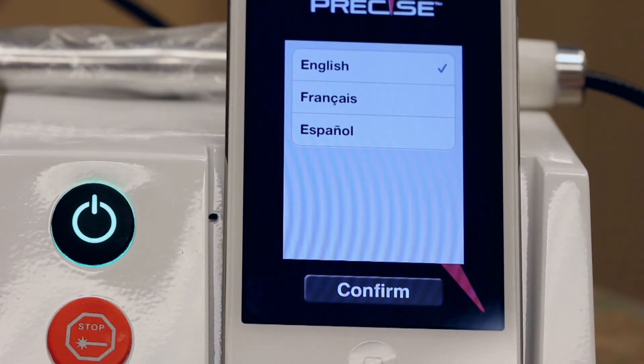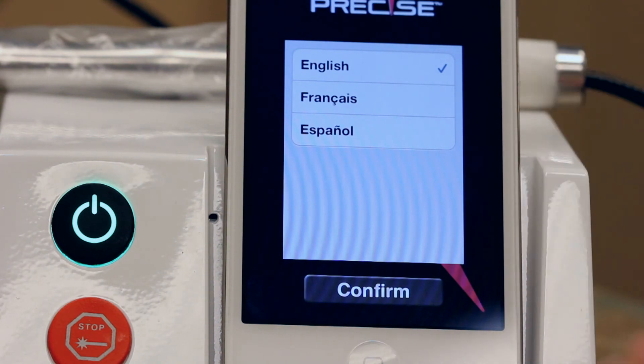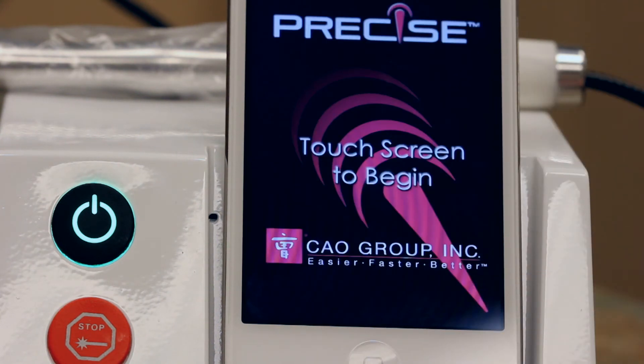You also have the option of changing the language of the SHP to one that's more comfortable for you — simply select the language from the list shown. The app will return to the start screen in the language you have just selected. Please note that changing the language affects only the Precise SHP app and not the rest of the programs on the iPod. Likewise, changing the language on the iPod does not affect the language setting on the SHP.